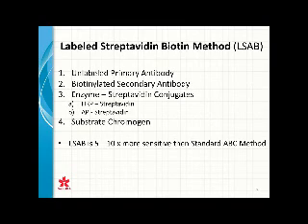And the difference is it decreases the non-specific staining because streptavidin is less likely to have that non-specific staining like the actual avidin-biotin method. So this method is a lot more sensitive, probably about 5 to 10 times more sensitive than the ABC method.